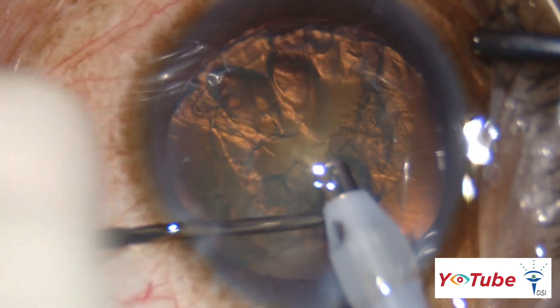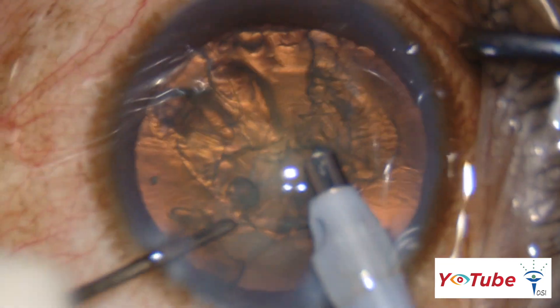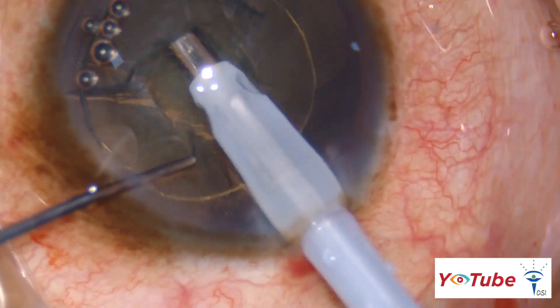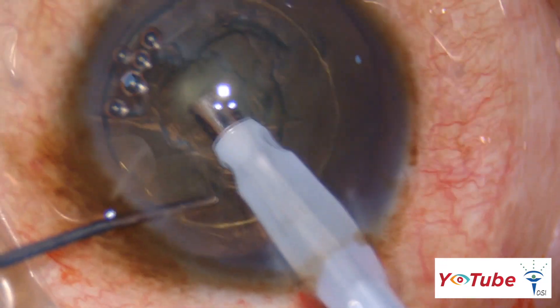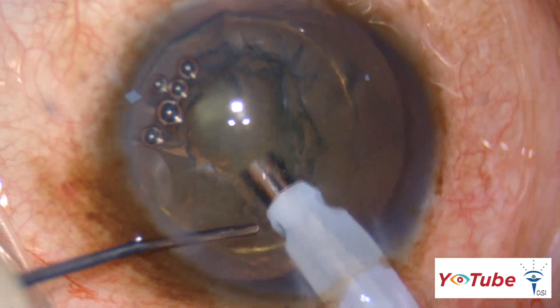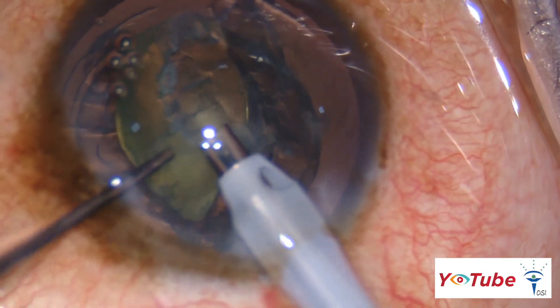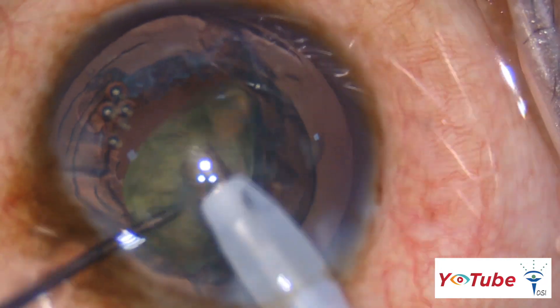It is important to avoid nucleus rotation as it can lead to a posterior capsular rupture. The technique of nucleus management depends on the grade of the cataract. For soft cataracts, adjacent trenches are created in the nucleus to create a bowl, which is then emulsified within the cushion of the epinucleus, as seen here.